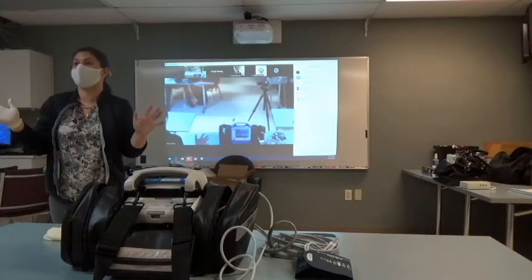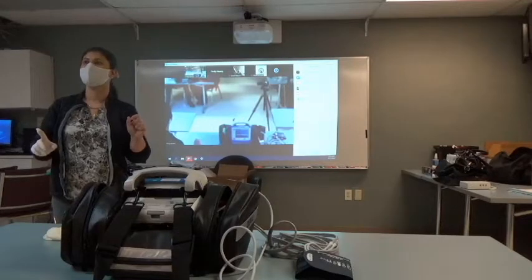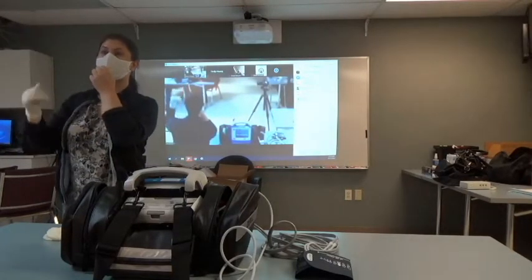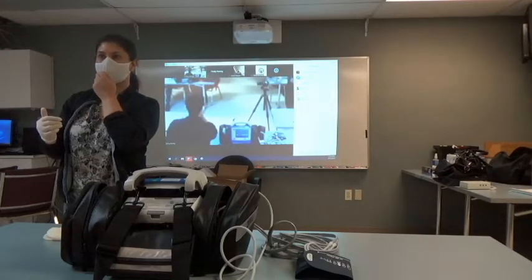Or for anything, to where you would need more than one lead on the screen. Are we asking about the home screen setup? Yes. Not the setup, just to where somebody can manually come in and add. Is there a need for you guys to do that at all? Yeah, I would like to be able to see multiple leads on the screen, but I would also like to understand what would go away if I add that lead.